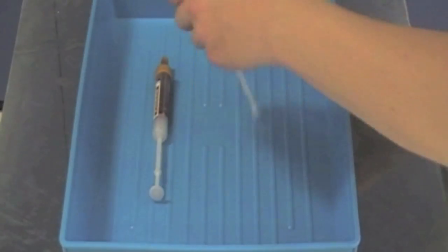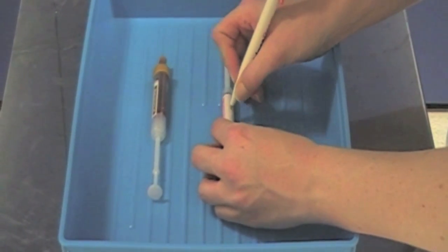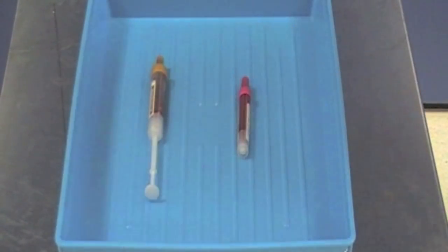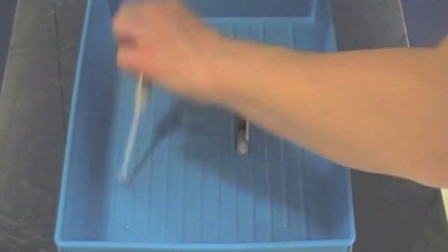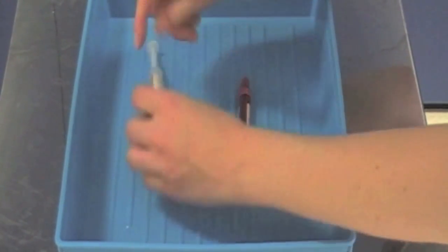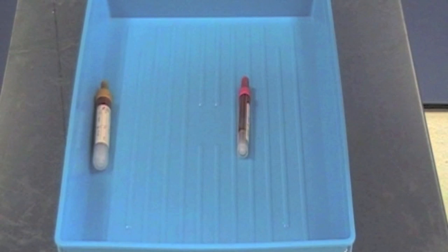Now turn your attention to the blood sample bottles. These must be labelled at the patient's bedside. Write clearly and legibly using black ink, ensuring that the ink from your pen will not smudge. Remove the plunger from the bottle by pulling it until you hear a click. At this point, gently snap off the plunger, placing it into the sharps bin, and repeat this process for all the bottles.